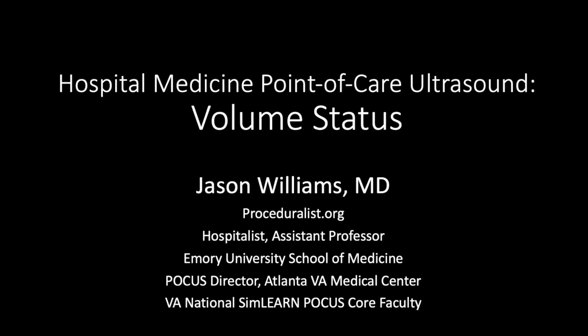I'm excited to have you here today for our hospital medicine point-of-care ultrasound course. Today, we'll address volume status. This is really one of the few ultrasound courses tailored specifically to hospital medicine, so I'm excited to share with you some of my insights I've gained over the years.